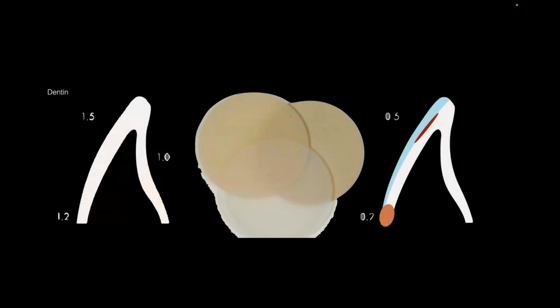I think most of you know that with powders, they're designed by the manufacturers, VITA being one of them, obviously, where we're creating the most opacified material on the inside, the dentin, which is less opacified, and then the enamels. The areas that we really struggle with as technicians are going to be these two areas here. The cervical third, which is really difficult because it's the thinnest area that we work in. And then the incisal third, which is usually the most difficult for two reasons.